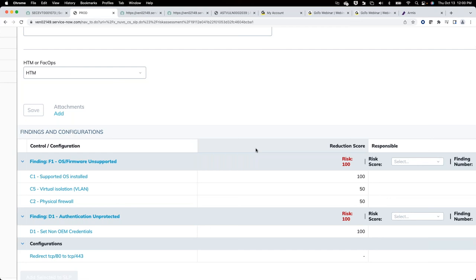So you can do that. I mean, you can connect it to a separate VLAN, let's just say, and then span that VLAN to us, rediscover it, give you a security posture on that device, monitor it, and then if it's all good, you can introduce it back into your environment. So that's one way of going about it.